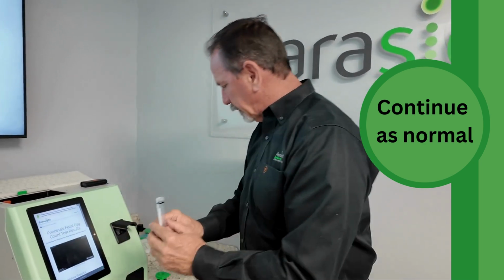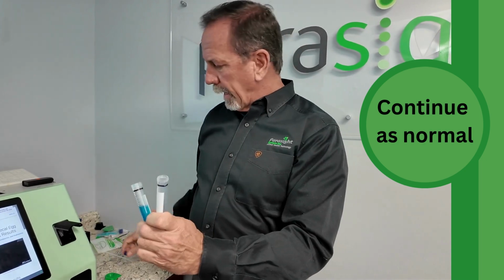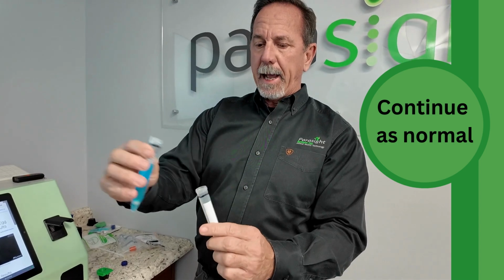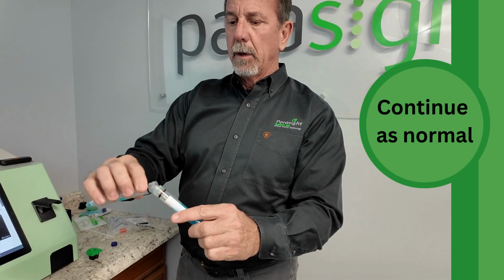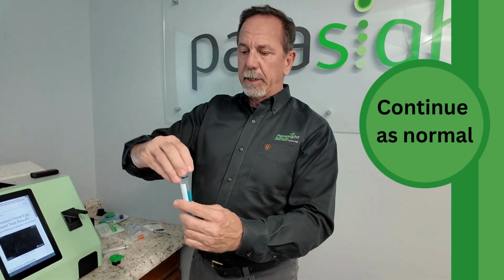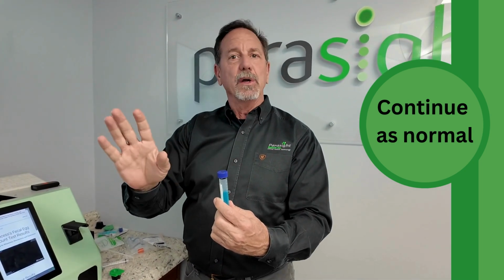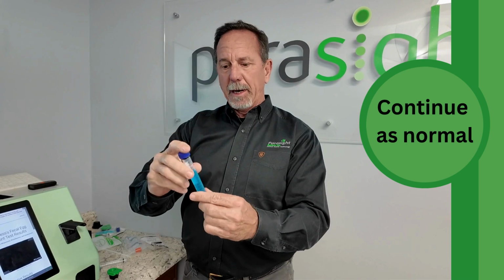Then what you're going to do is you're going to open up another pack, and you're going to go ahead and borrow the colored Fecasol out of that pack, and you're going to pour it back into this one without the ball. Now what you get to do is we're going to do the same thing we'd normally do, like there's no mucus in this, just like we started over.